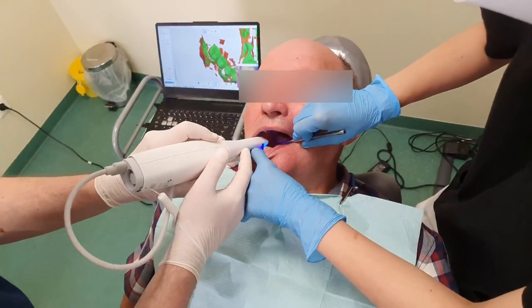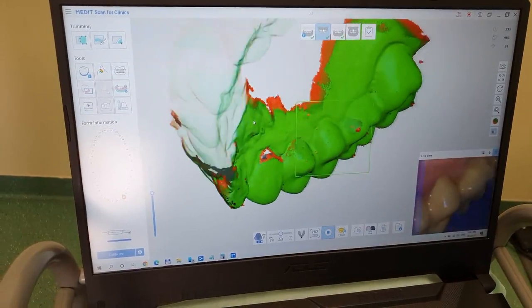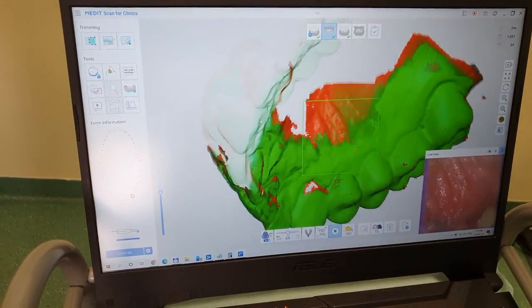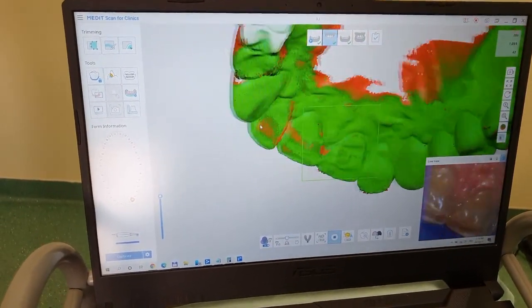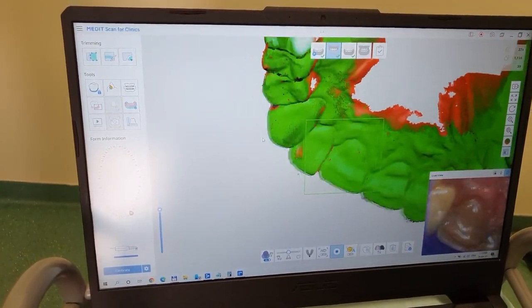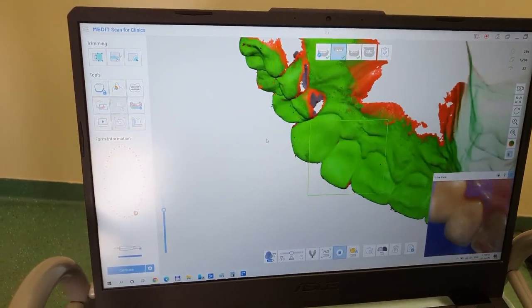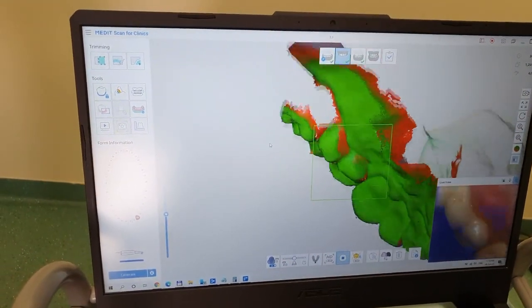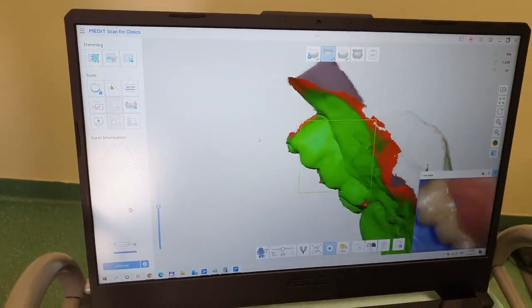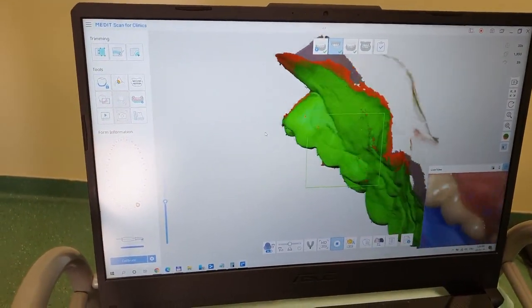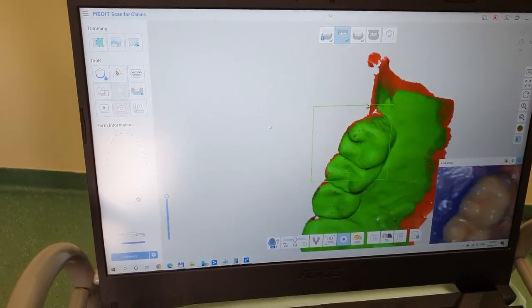Today we'll be doing a single crown prep and scan, and we'll follow with building the actual model first in the software itself and then printing it on our printers and we'll see how that comes out.